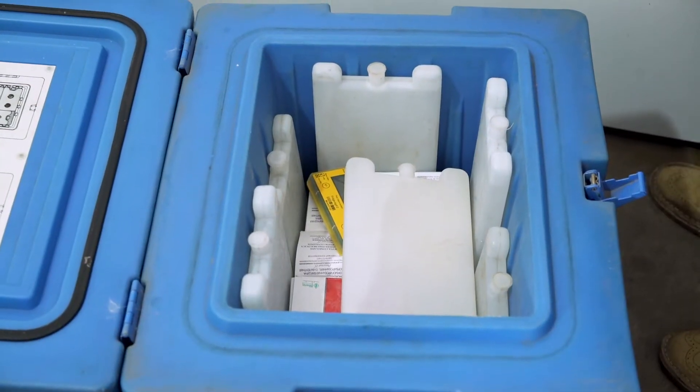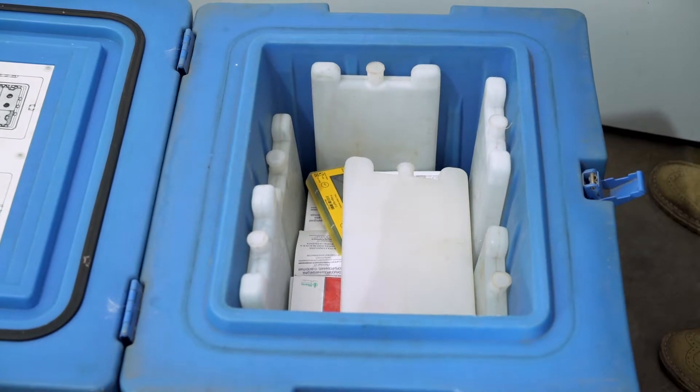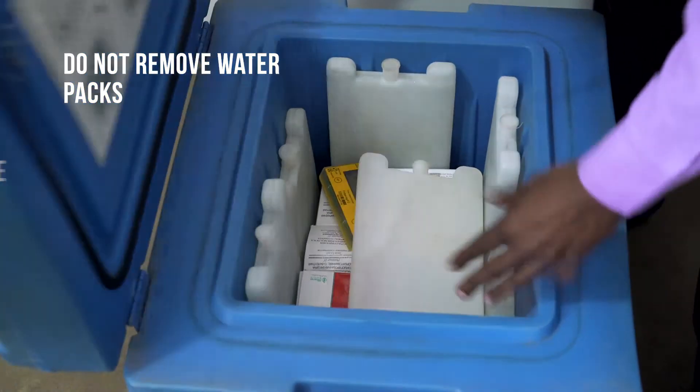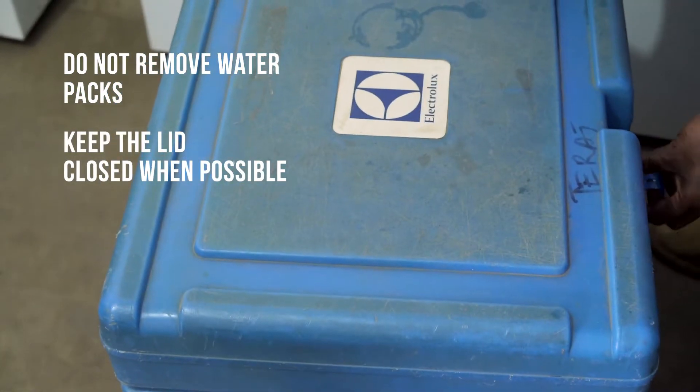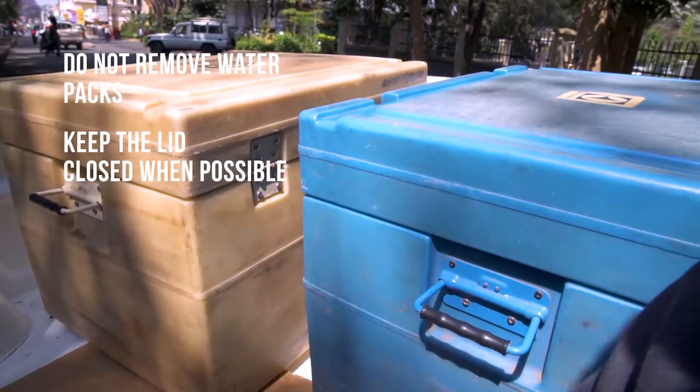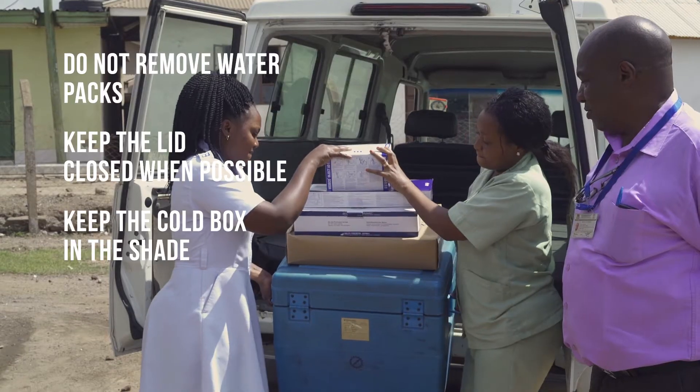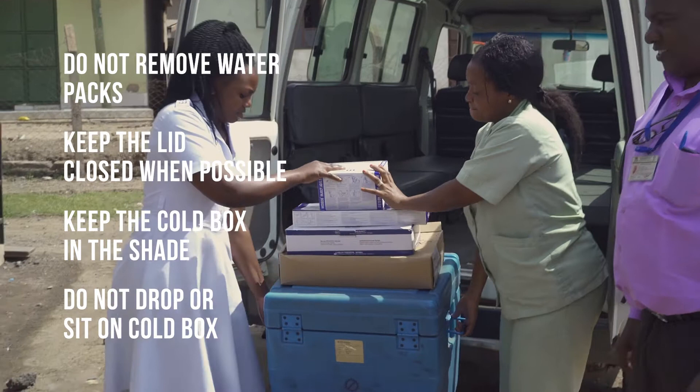Here are some key things to remember when storing vaccines in a cold box: Do not remove the water packs from the cold box. Keep the lid closed tightly whenever possible. If you are using the cold box to transport vaccines, keep it in the shade. Do not drop or sit on the cold box.